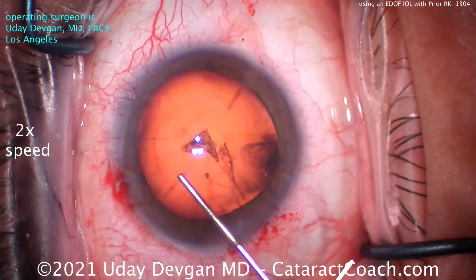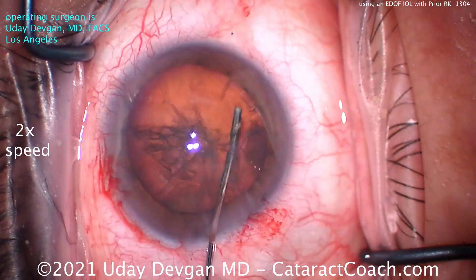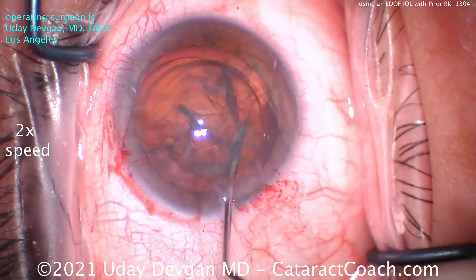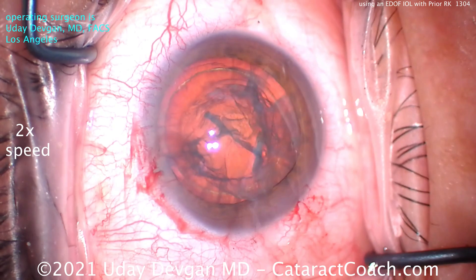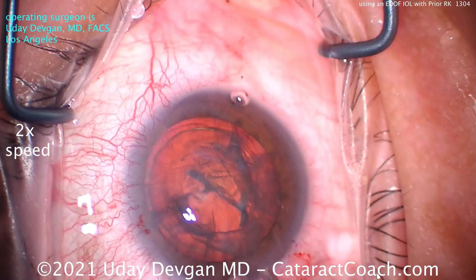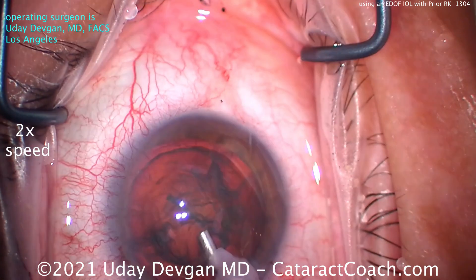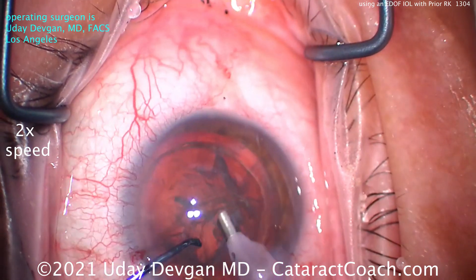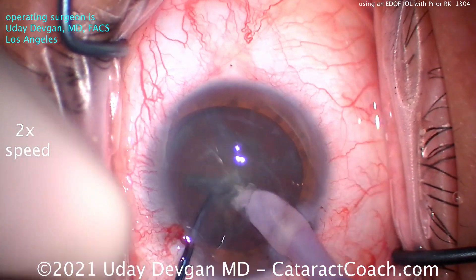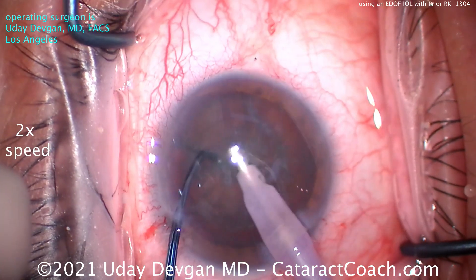But I've essentially changed my mind on this after talking with Shannon. Dr. Wong has many patients with prior RK on whom he's implanted these EDOF IOLs, particularly the Alcon Vividi. I have a patient here who has very reasonable expectations — prior 8-cut radial keratotomy and a little bit of corneal astigmatism — and I thought this patient would be a good choice for this EDOF lens.